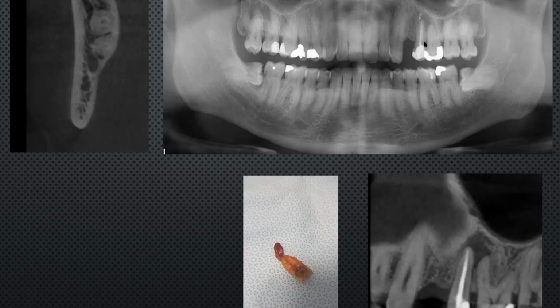Yeah. So an ideal case in something like this, you would try and preserve the papilla, cut just inside of either papilla there, make an incision across the ridge, plus or minus some releasing incisions on the buccal sulcus. If you're doing one relieving incision, would you put it mesially or distally normally? Say that again. What would be mesial? I would actually tend to go distally for aesthetics, to be honest. Okay. Yeah. But yes, if I have to make one, especially if one has to be longer, then I'll tend to extend the distal one.